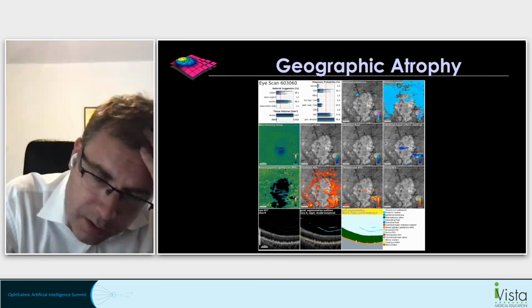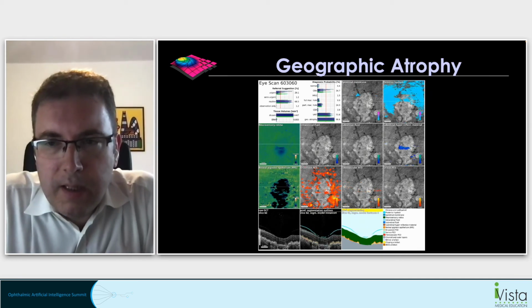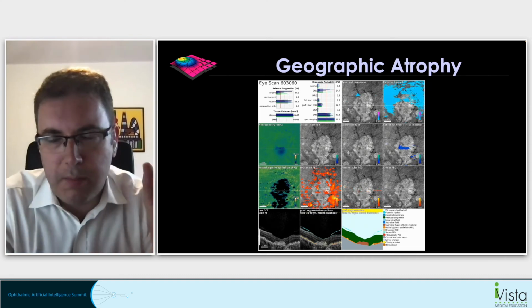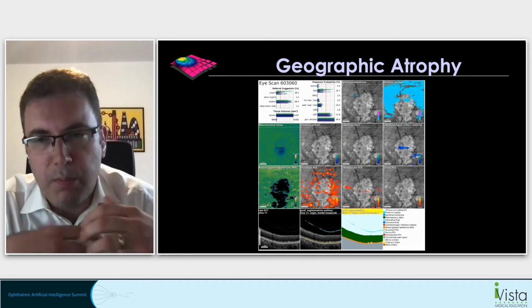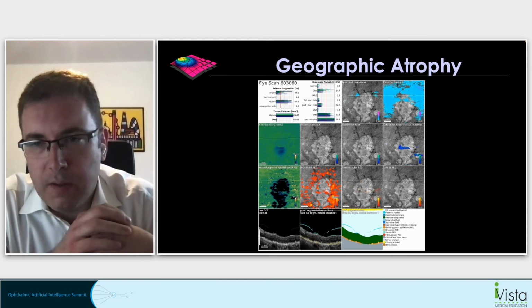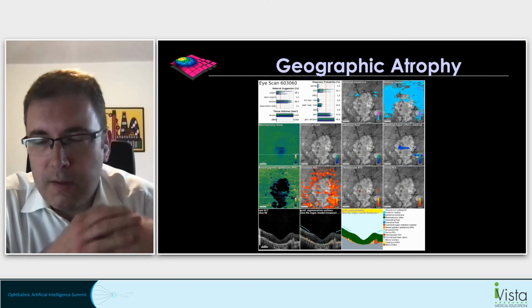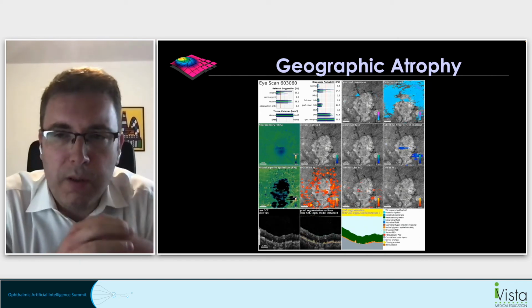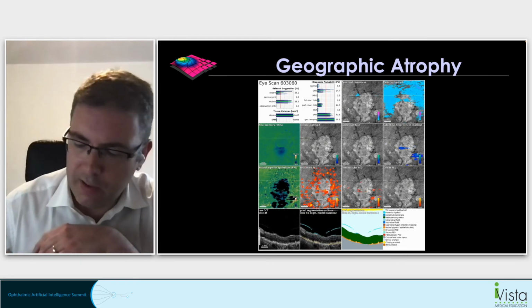One of the other things to point out about our model is that because we have this segmentation network followed by a classification network, it works very nicely across multiple different OCT devices. So including some of the main manufacturers such as Topcon and Zeiss and Heidelberg, and it can easily be updated as new models of these systems become available.